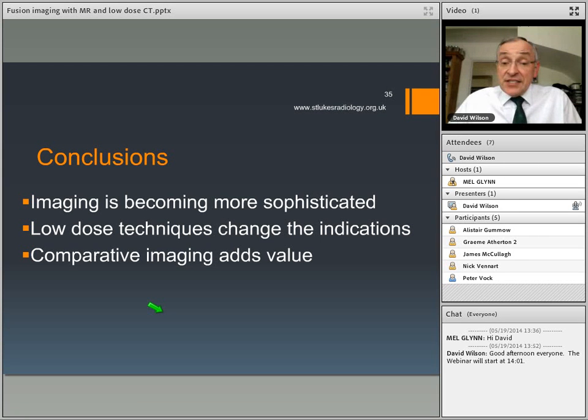It teaches you better anatomy, gives you understanding of the ultrasound you're doing, but in particular, it starts to allow you to place needles and to position without using any radiation. So ultrasound and MR, no radiation involved whatsoever. Extremity CT, small dose to the patient, none to me. I can see huge advantages. So that's all I wanted to talk to you about, and we'll throw the field open for questions. I can see them coming up on the screen if you'd like to let me know.